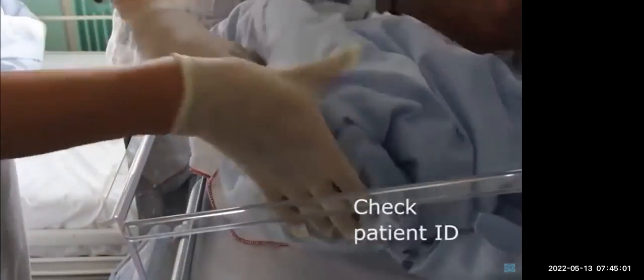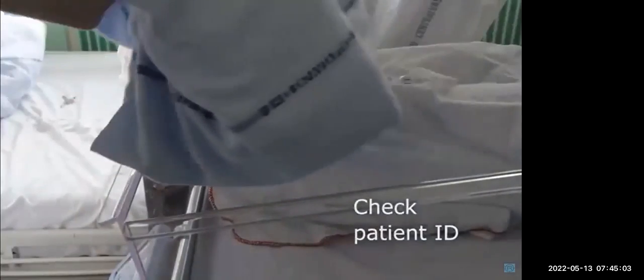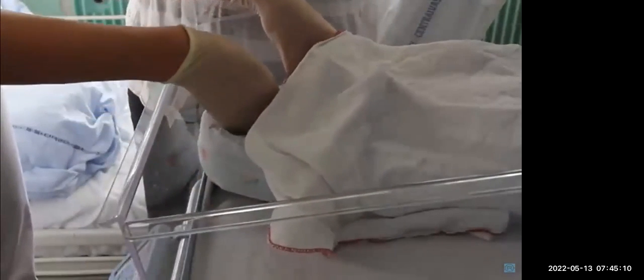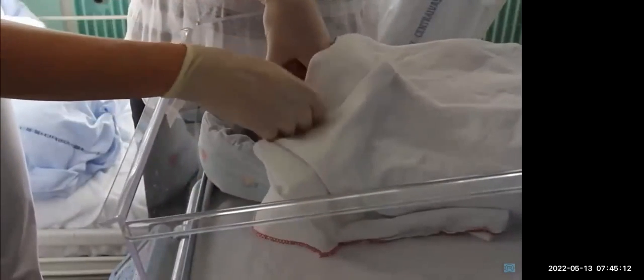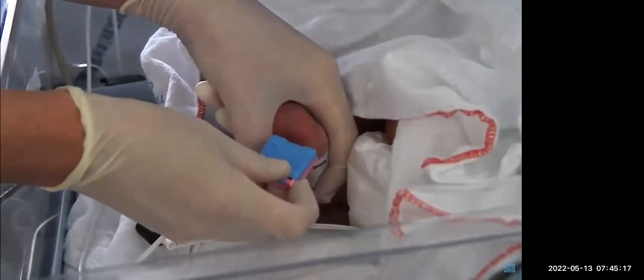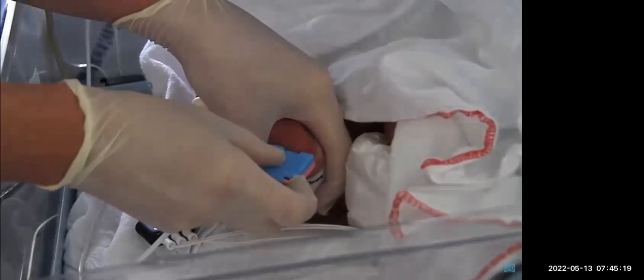Before sampling, confirm the patient's identity. Make sure there is good blood flow to the sampling site. Disinfect the puncture area. Make an incision of maximum 2 millimeters depth on the plantar.